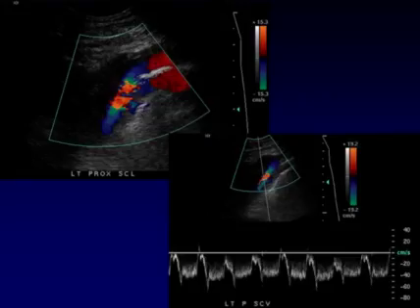You can have partial thrombosis in these cases. In such cases, you will usually find an area of elevated velocity, and it's interesting that in this area, usually the phasicity will return once you get into the actual area of narrowing, as is the case here, and you can see that there is partially occlusive anechoic thrombus to one side of the vessel. You can see an area of color aliasing within that narrowed region, and it's confirmed that there is high velocity flow in this selected region by the spectral tracing itself.